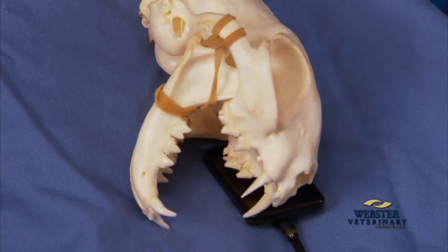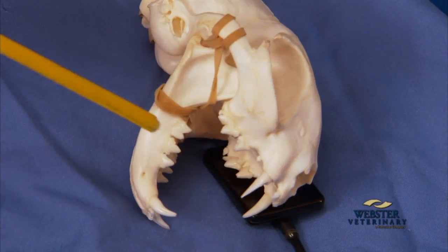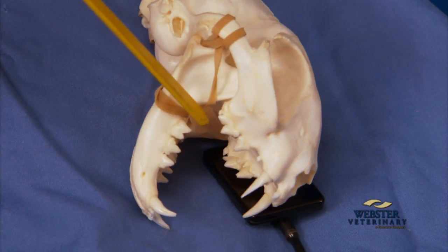In order to properly image the premolars and molars of the maxilla in feline patients, it's important to learn the extraoral near parallel technique. In fact, that's a preferred technique by most clinicians to avoid superimposition of the zygomatic arch over the roots of these premolars and molars.